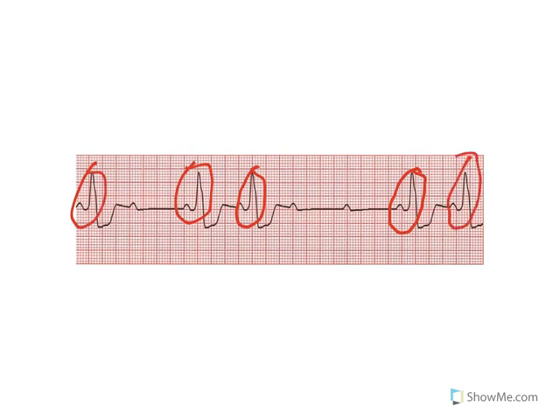But we do have a problem, don't we? What is this little P wave doing out all by itself? It's too small to be out by itself. It doesn't have a QRS to correspond with it. We would expect QRSs to be here. Okay? This is the telltale sign that you have a second degree type 2.